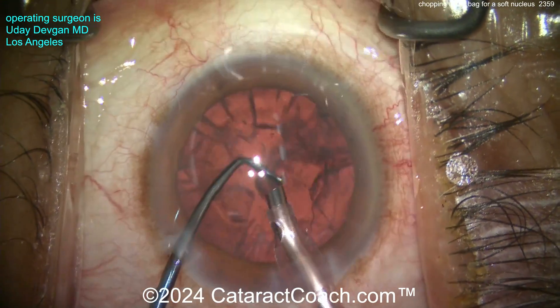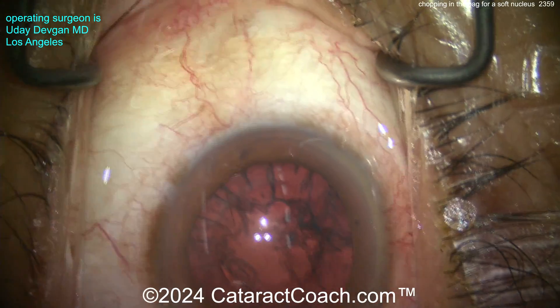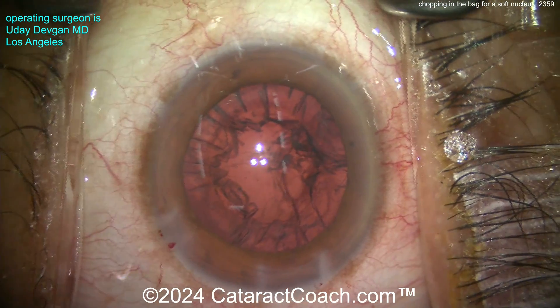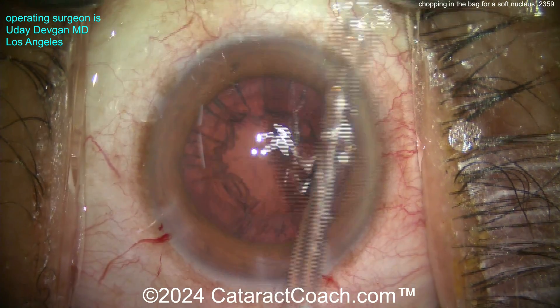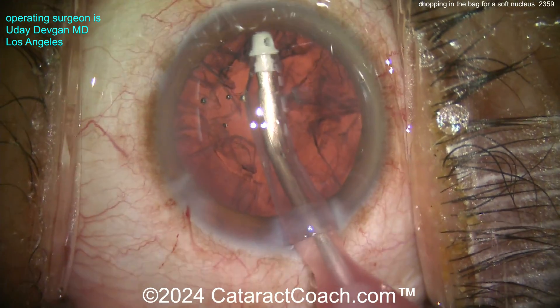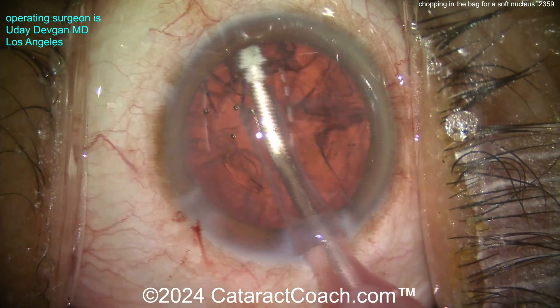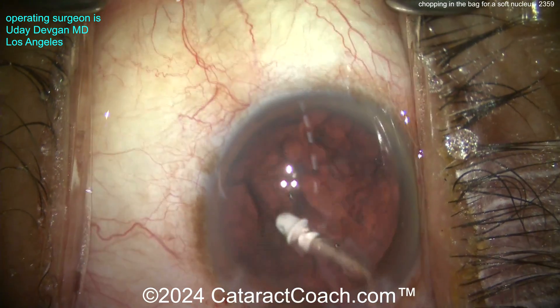We're showing the entire case start to finish, unedited, so you'll see all the little details. Look where the chopper goes in — that safe position just to protect the capsule bag. Now the rest of the cortex — let's remove it with the irrigation-aspiration probe. You can see those incisions. I do like to barely nick the limbal vessels; it gives good long-term healing and sealing of the incisions.